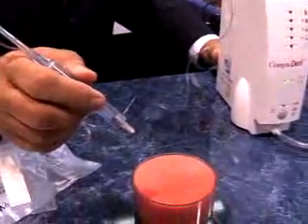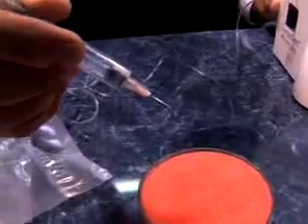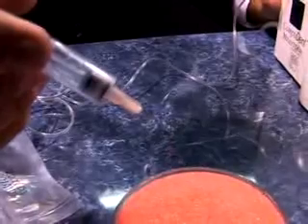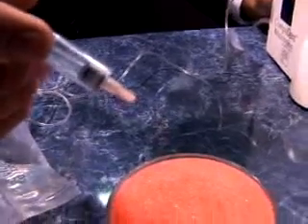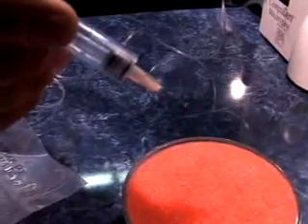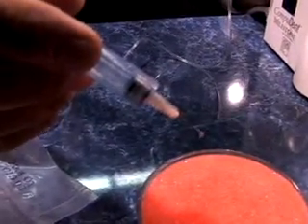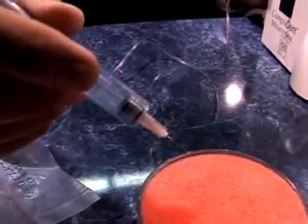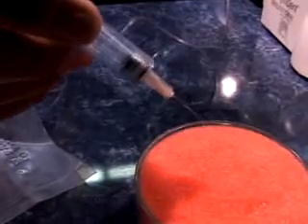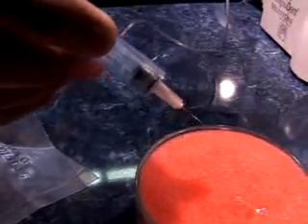What I'm doing now is purging the air out of the system, and this produces two flow rates. The control flow, which is a drop every other second. And at this rate, this needle could be anywhere in the body and the patient would not feel the delivery of the anesthetic. This is below the patient's pain threshold. There's also a rapid flow, which can be used for blocks and infiltrations when the anesthetic can be delivered in a shorter period of time with a larger volume.